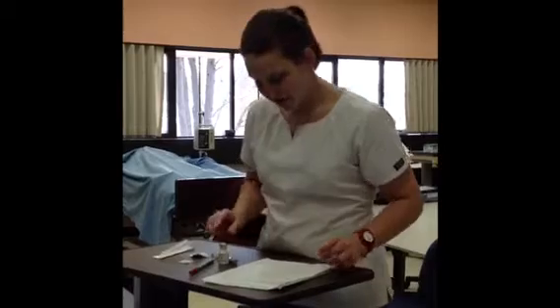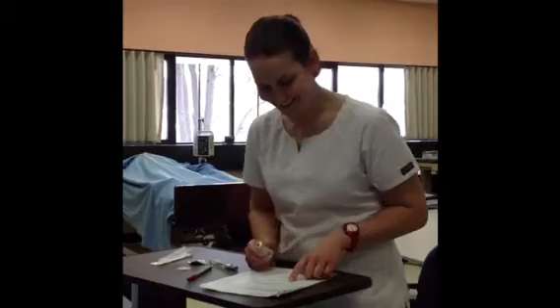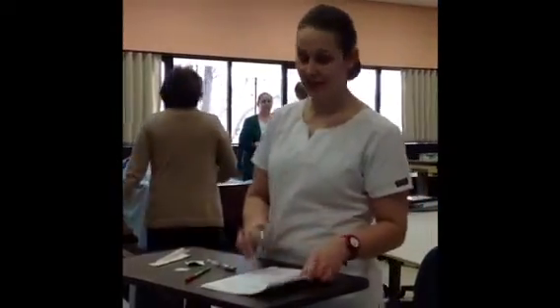I drew up the medication. I'm going to just check it one more time. Patient, Allison Alvarez, hepatitis B, 0.5 milliliters, intramuscular injection. Vaccination is the reason, and it's an open order to be given now, so everything's all set. I would put the medication away, lock the cart, and I'm ready to go administer it to the patient.